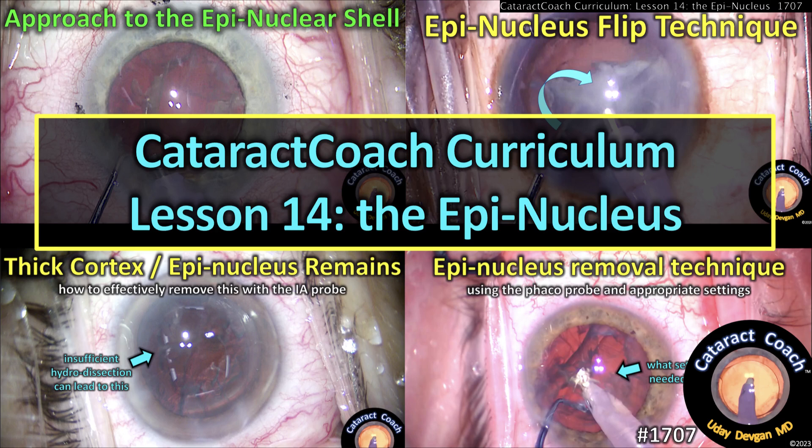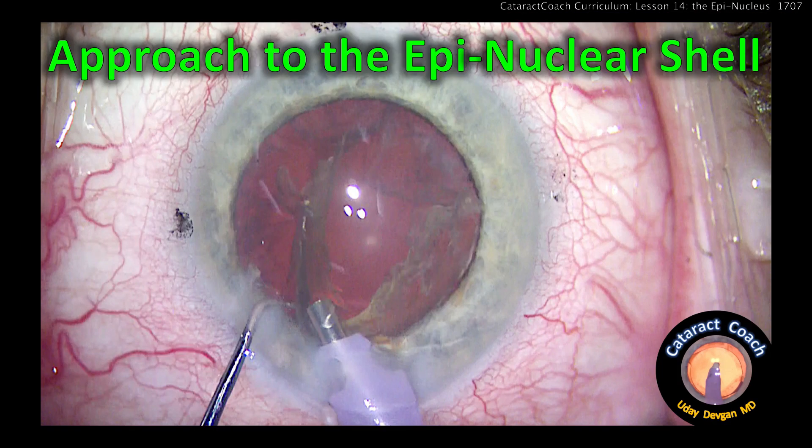CataractCoach.com, curriculum lesson 14: the epinucleus — how to remove it safely and efficiently. The approach to the epinuclear shell in cataract surgery.